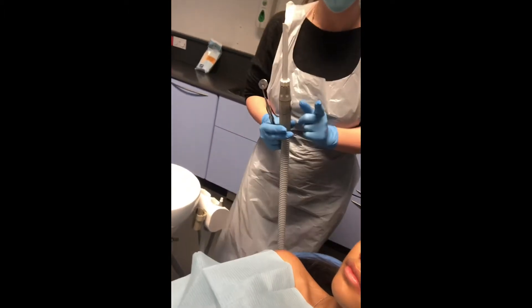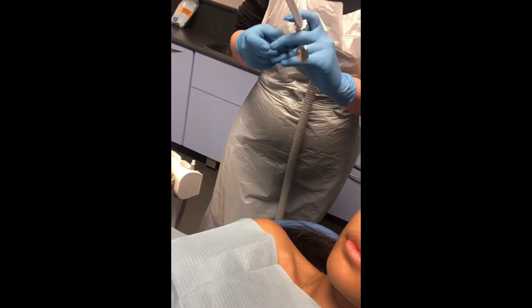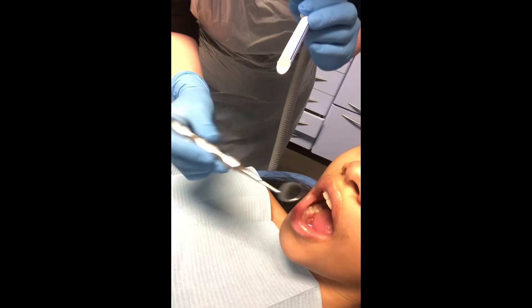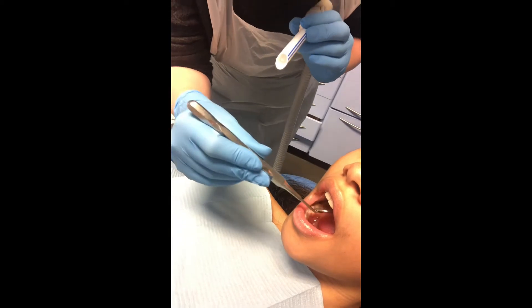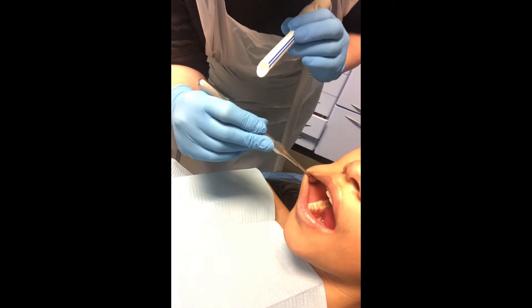I'm not going to turn the aspirator on because it's going to be too noisy and you won't be able to listen. So if you need to aspirate, feel free to use the mirror to retract — you should be rolling it around and getting used to the mirror. Place it in and then pull the area out like so.